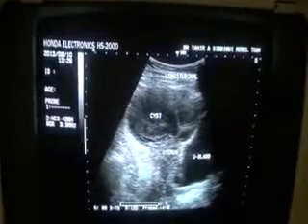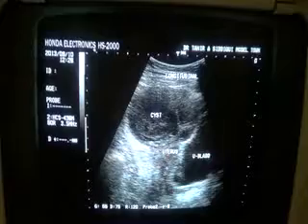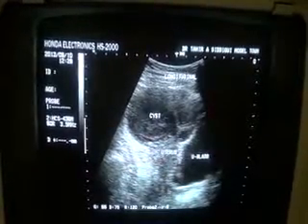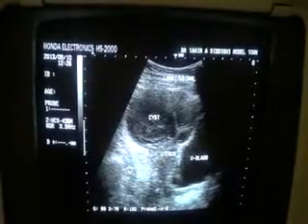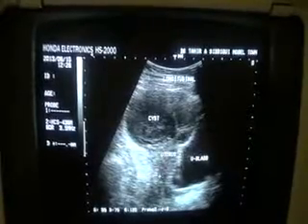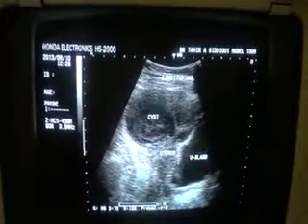And in this case the prognosis may be better, as we can see the endometrial lining in this case. This is the vagina, this line, cervix, endometrial canal, and this is the myometrium. So in fact a hypoplastic uterus will be the diagnosis. Thank you very much.